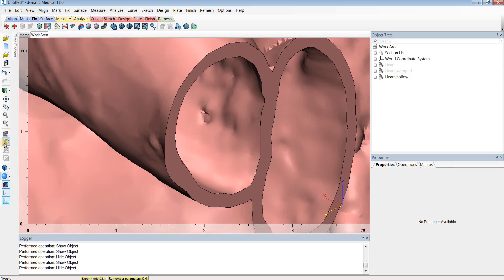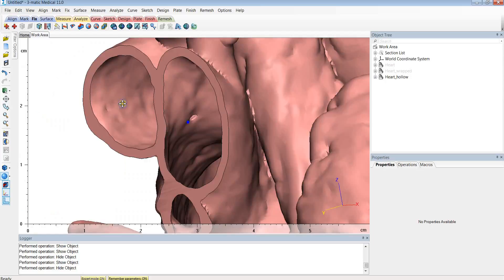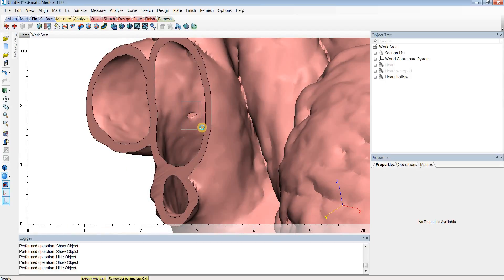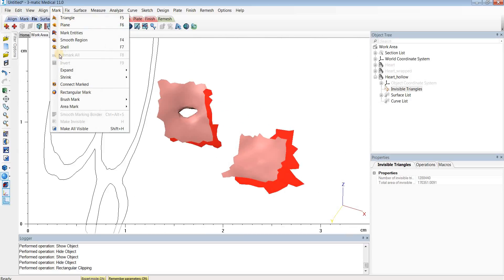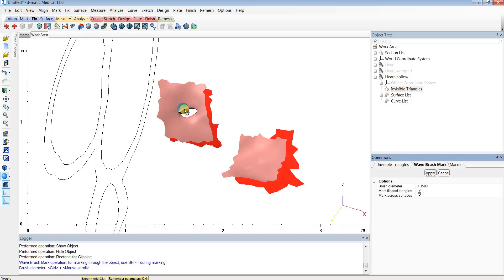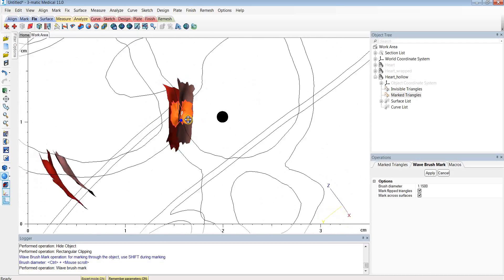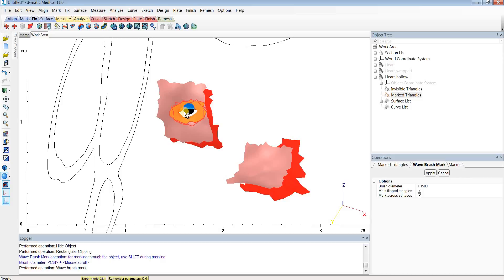The first thing I'd like to do is use the rectangular clipping button to isolate the region of the hole. Once I've drawn a rectangle around that hole, I'll go to the Mark menu and do Brush Mark - Wave Brush Mark. You can also hit M as a hotkey. Now I'll mark the region surrounding those holes, holding down the Shift key so it marks all the way through the screen and marks both sides of the hole.